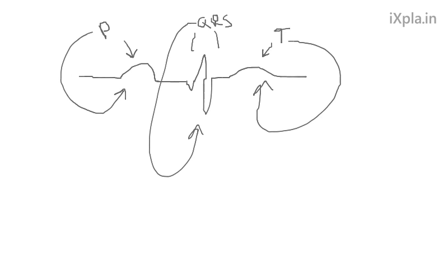Now, this can get tricky with questions. There wouldn't be a question like, what does a Q wave represent? Because I don't think that's gone over in the book. That's more advanced cardiology that they don't really explain, because it's really not that important what the Q wave represents. But the Q wave represents the depolarization of that septum in the middle of the heart. But again, that's not really important to know because it doesn't affect anything. Some people have it, some people don't. Now, if the Q wave is extremely large, you'll find out in the third test that it signifies someone had a myocardial infarction in the past. But as of now, who cares what that means?